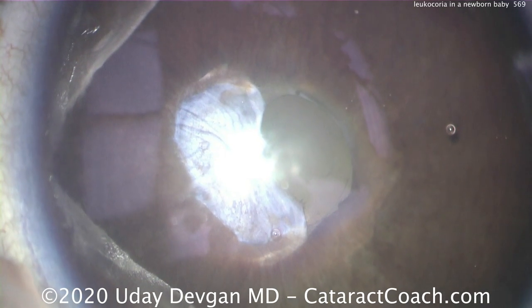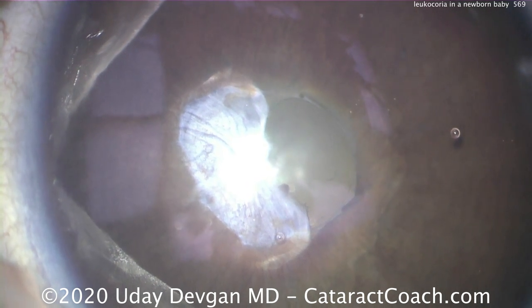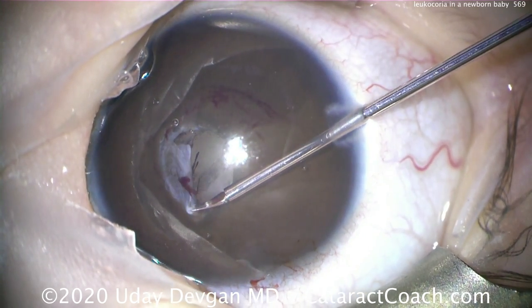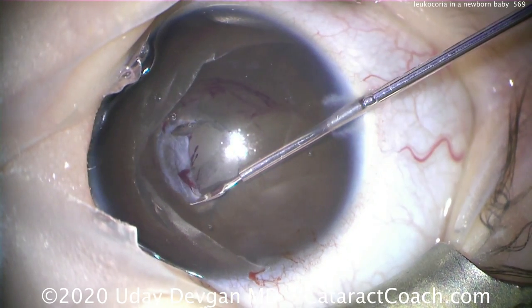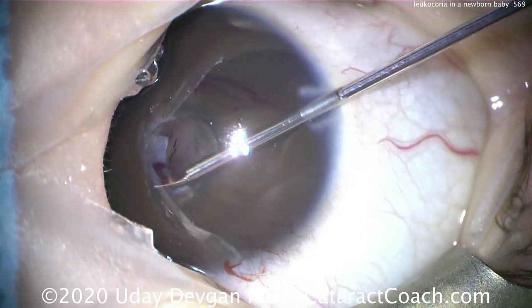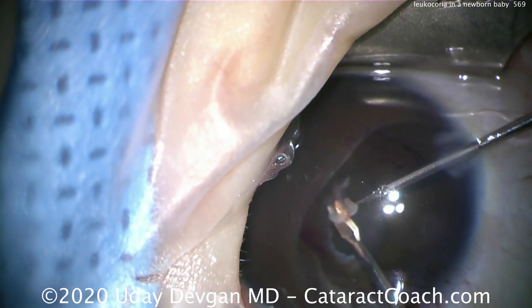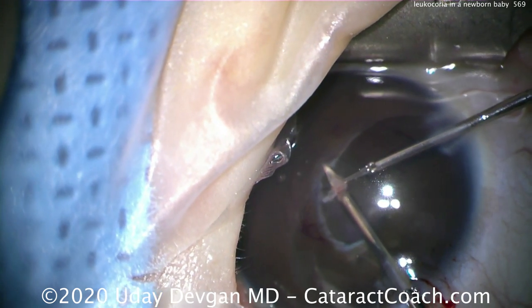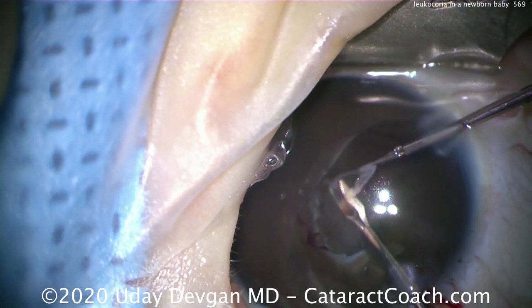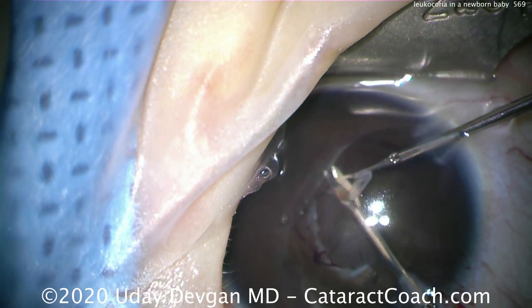Here's the high magnification view — this is the maximum pupil dilation we could achieve with pharmacologic means, so we'll need to remove this pupillary membrane. We want to use 25 gauge retina micro scissors in order to do that. There's a small amount of bleeding, but it's insignificant. Very careful here — you don't want to just pull on it. We're using a two-handed technique: one hand with the micro scissors, the other hand with micro forceps. The 25 gauge retina instruments are great for this, and we can remove the majority of that membrane to restore a nice, normal pupil anatomy.